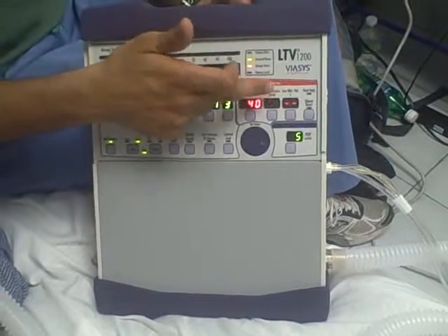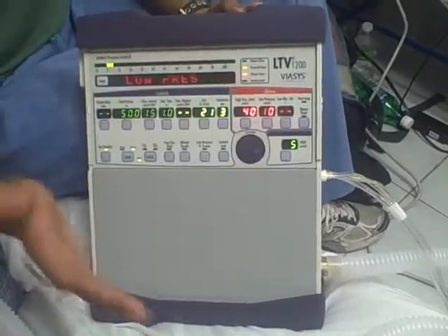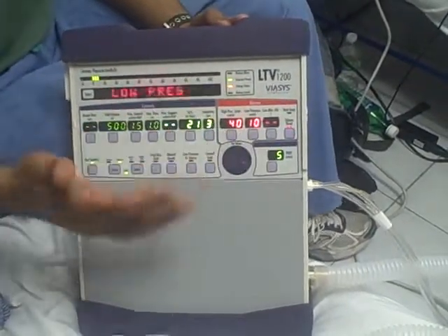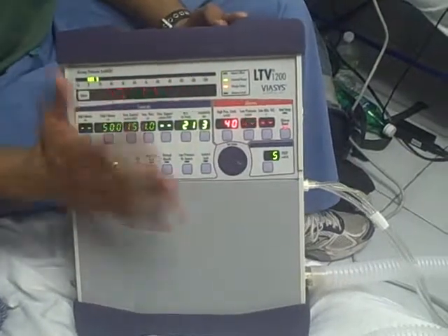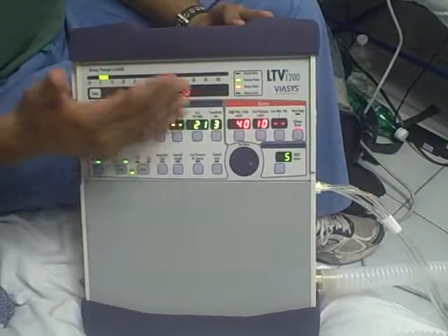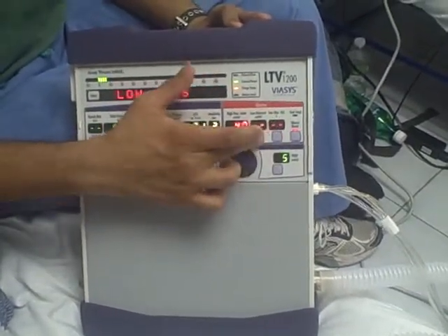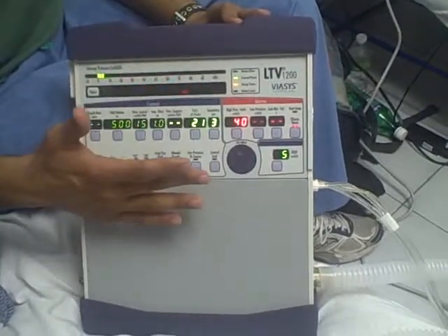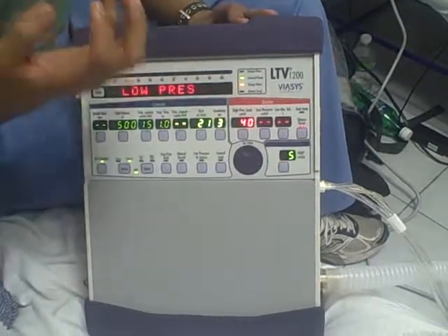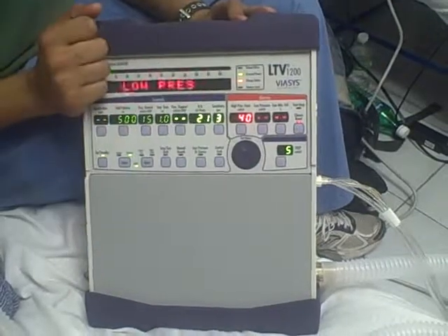This alarm is mostly for times when you have a patient on the vent. In order to turn off a beeping alarm, you have to hit the silence reset button, which is on the right. It's the most important button on the machine because it becomes extremely annoying to have the machine continue to alarm at you. If you want to turn off that alarm, you hit the button, dial it to 0, and then select it again. You'll no longer have a low pressure alarm. The same is true for the low minute volume alarm. Again, in BiPAP, it can't accurately assess the tidal volumes, and so low minute volume will continue to alarm.